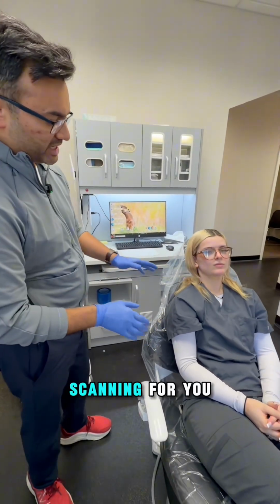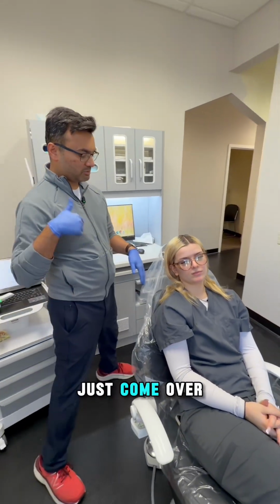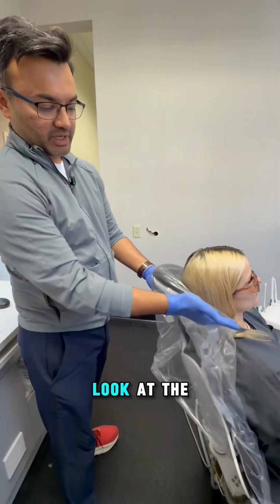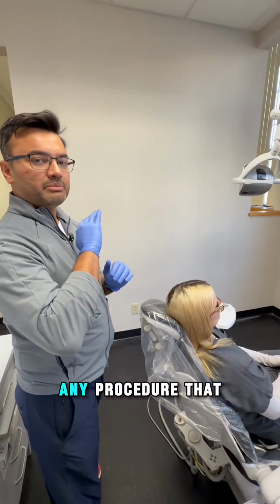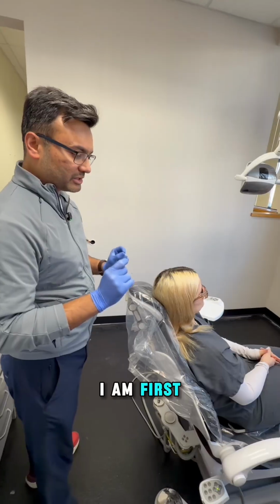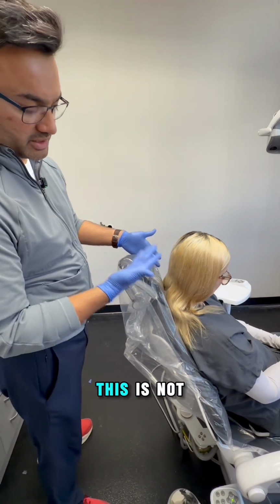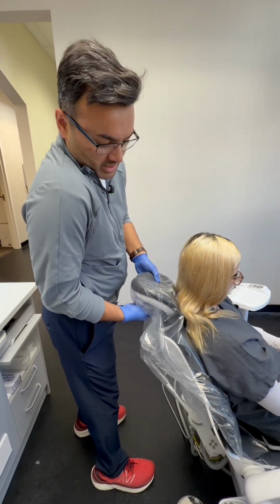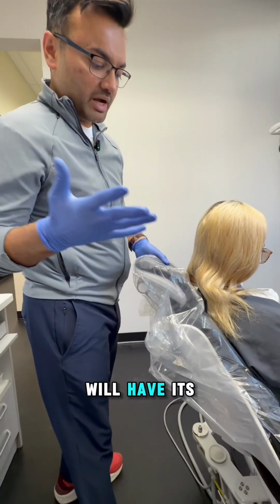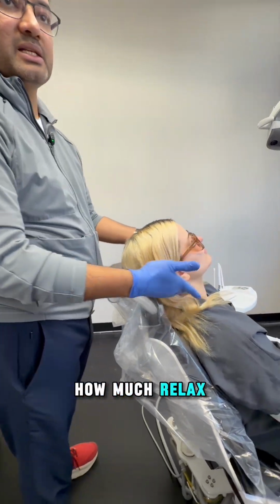All right, we're going to start scanning for you. Nobody's noticing, but what's the biggest problem that we have here? Just come over this side. I see this all the time. Look at the headrest position of the patient. That's not comfortable. Any procedure that I'm starting, I am first looking at what position the patient is seated in. So lift your head forward. This is not seated according to the patient's height. Bring your headrest down. Again, every chair will have its own adjustments. Rest your head back. You see how much more relaxed the neck is?